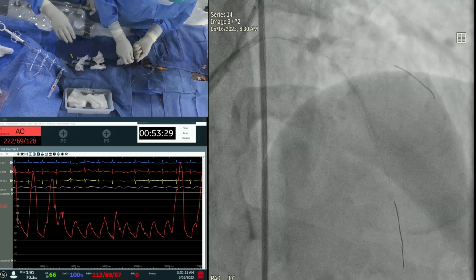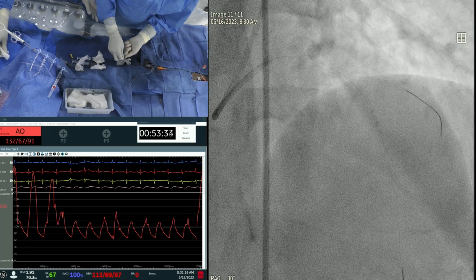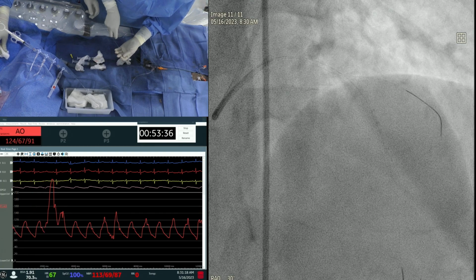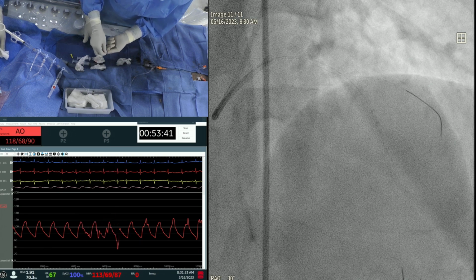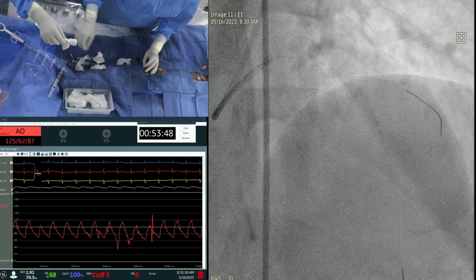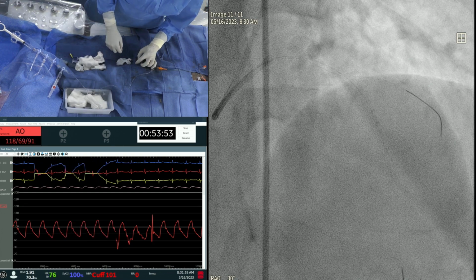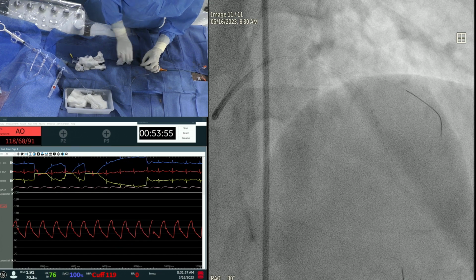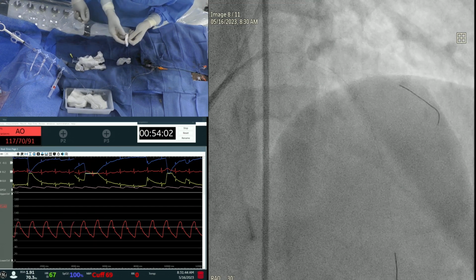So Anu, there are two people who have mentioned, they seem interested in understanding the distal left main with imaging. Good observation, absolutely. That is the plan. In fact, we'll dilate the diag and then we'll image the distal left main and the stented segment, as Samin mentioned, the post-procedural value of IVUS or imaging for that matter.